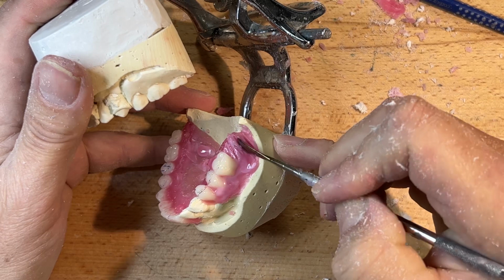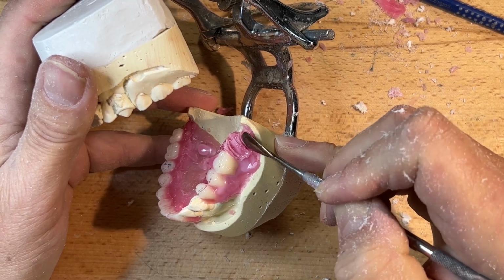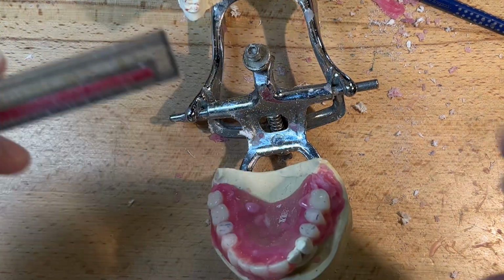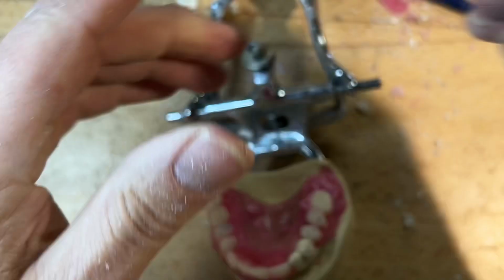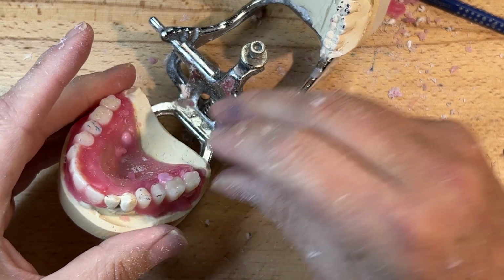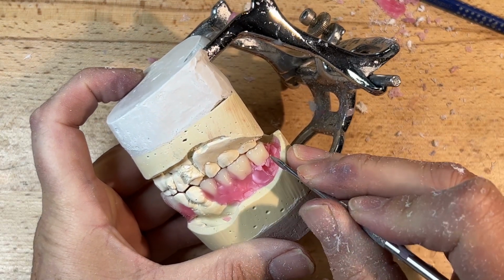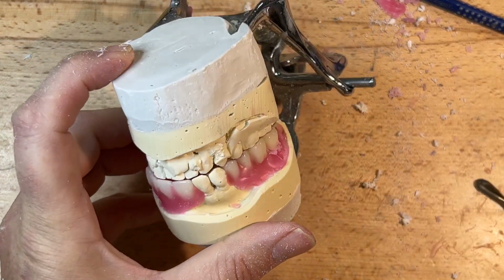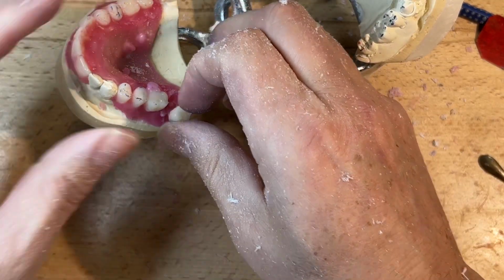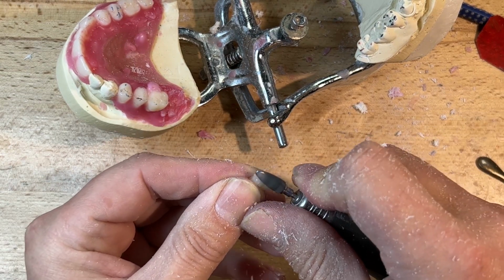So, you know, the master molds of the denture tooth manufacturers, whether they're American or European, are they including molds? Are we customizing those molds to fit the rest of the planet? Or are they ethnocentric in their manufacturing master mold? I find some of them are, but there's lots there to customize anterior setup, posterior occlusion. Predominantly in the anterior setup, you're going to see these stereotypes.